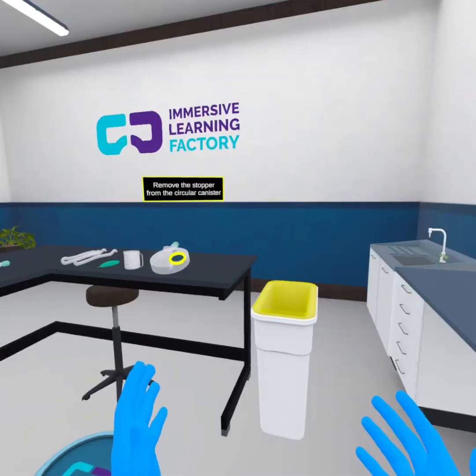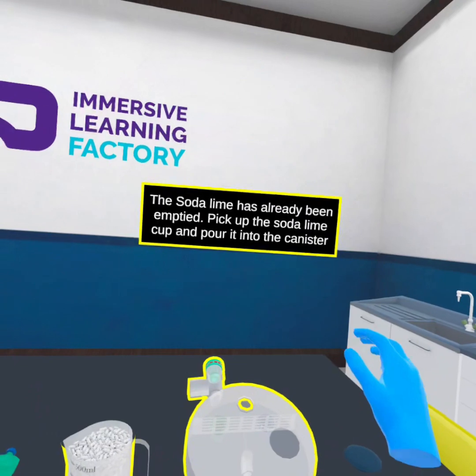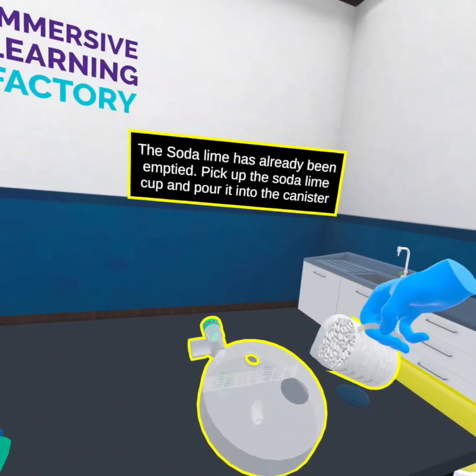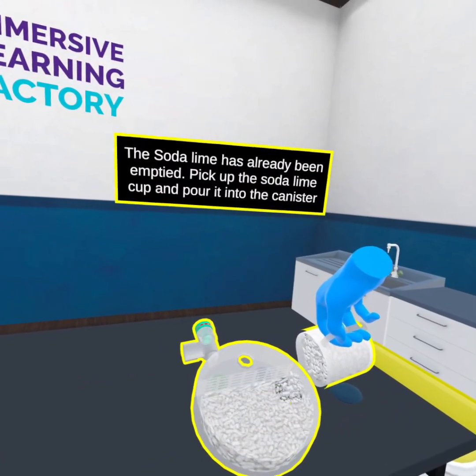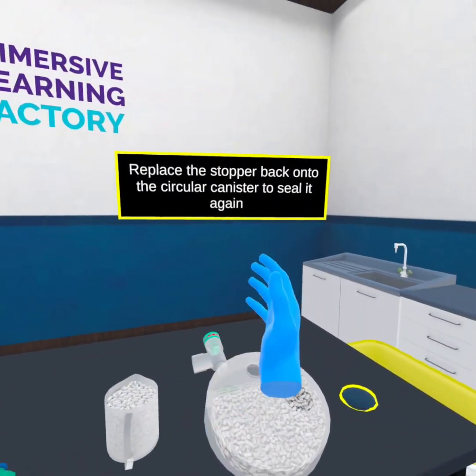Remove the stopper from the circular canister. The soda lime has already been emptied. Pick up the soda lime cup and pour it into the canister. Replace the stopper back onto the circular canister to seal it again.